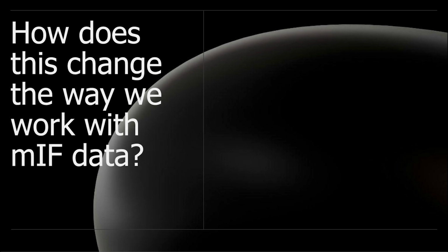So how does it now change the way we work with MIF data? First, it's of course convenient. And second, it's also easier for onboarding, because biologists are primarily interested in finding areas within the tissue that confirm the hypothesis, or interesting areas to find new hypotheses. And so they don't really want to learn new tools, they just want to use them.